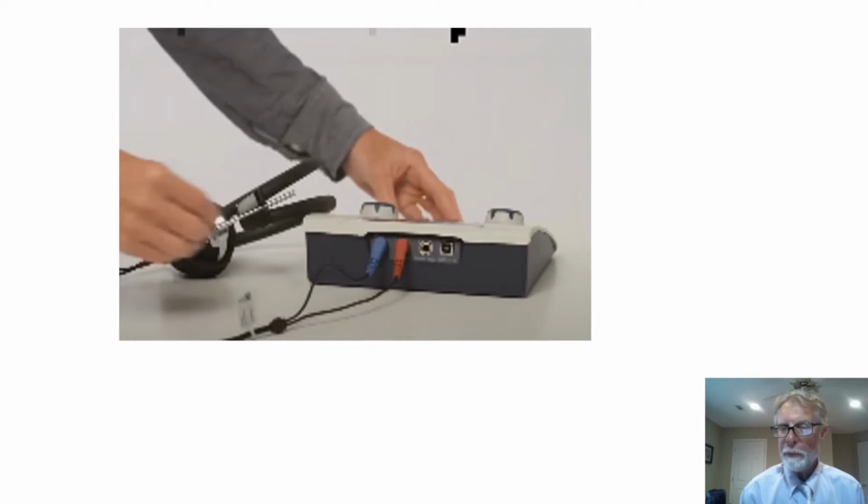They also have to plug in the power supply, either the power cord if it plugs in, or the power supply. And there might be one more thing to plug in, and it could be a hand switch. That's a switch that the patient can hold in their hand and push the button when they hear it, and a light or something comes on the face of the audiometer to tell you that they responded. Otherwise, they would raise their hand when they hear the tone. All right.